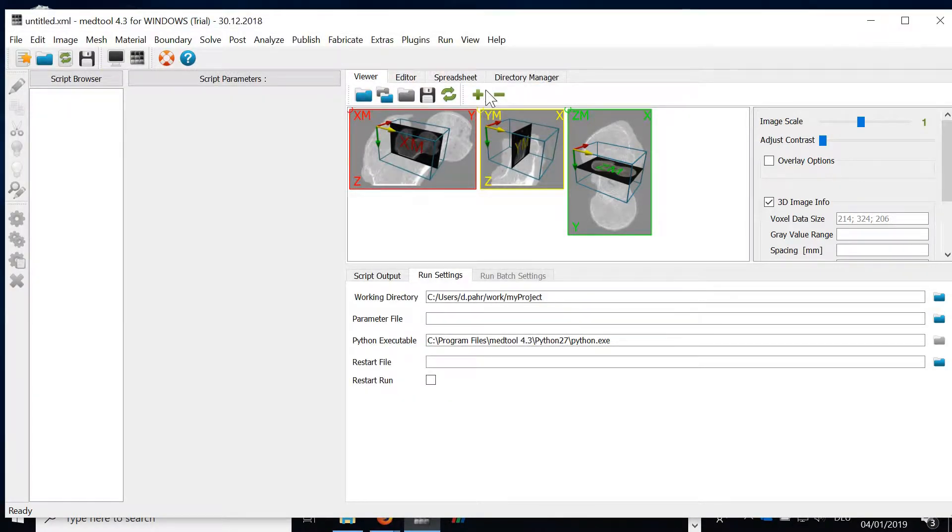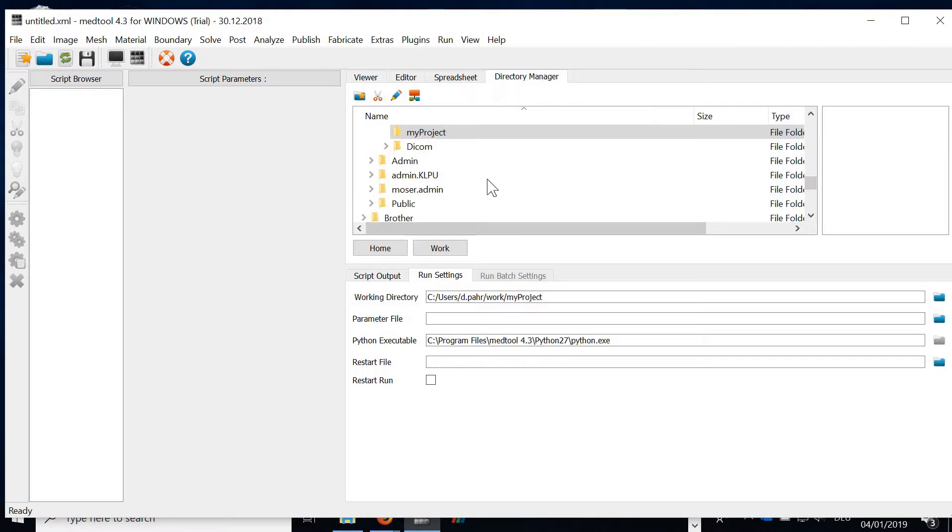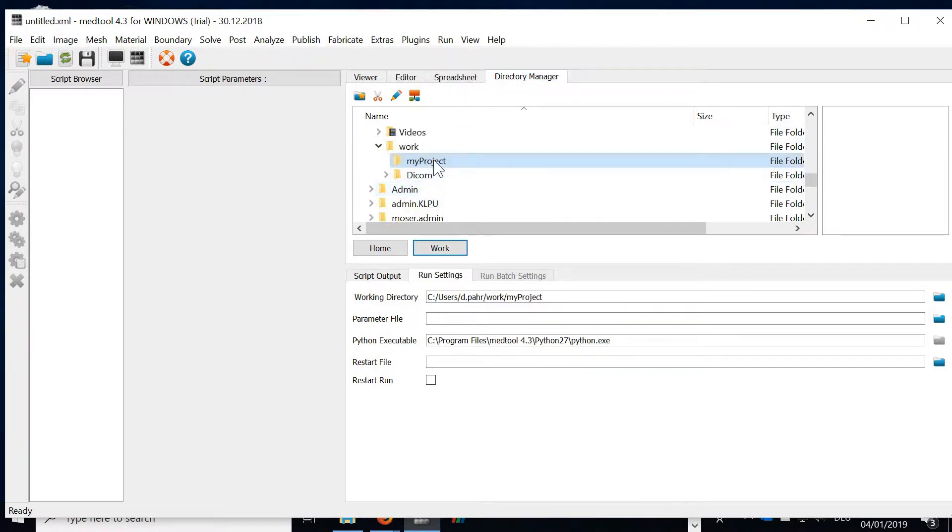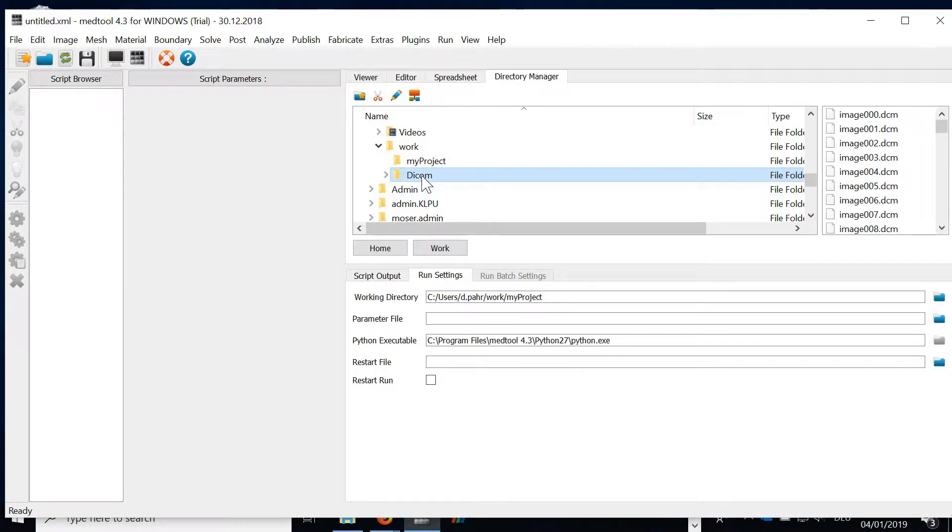Now we can go to the directory manager. If we click to work we directly come to our working directory. We see we have one folder project and one folder DICOM images.